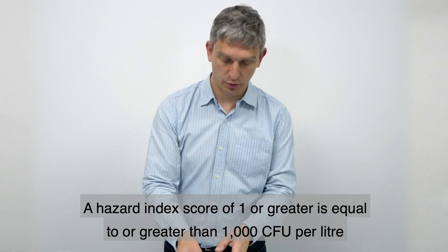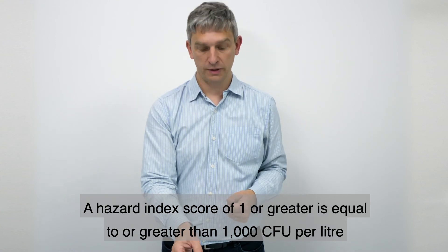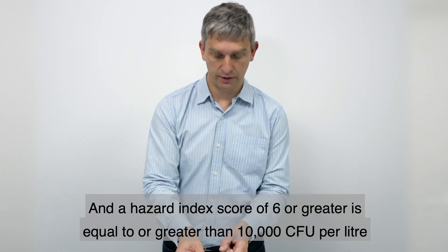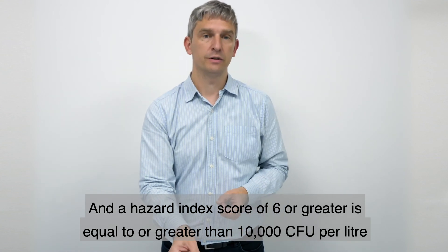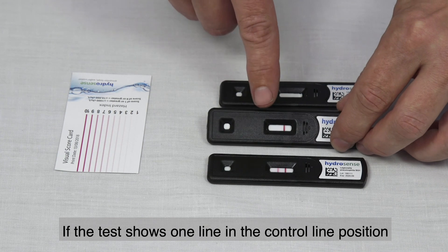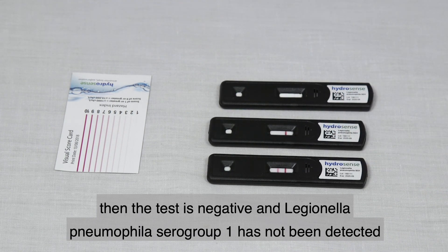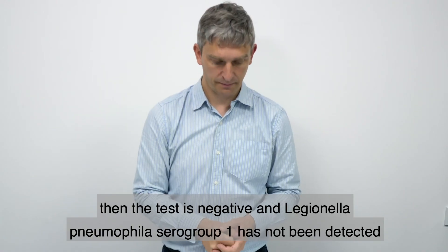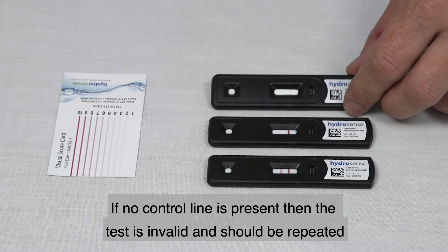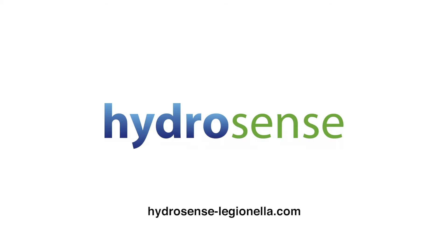A hazard index score of one or greater is equal to or greater than 1000 CFU per litre, and a hazard index score of six or greater is equal to or greater than 10,000 CFU per litre. If the test shows one line in the control line position, the test is negative and Legionella pneumophila serogroup 1 has not been detected. If no control line is present, the test is invalid and should be repeated.